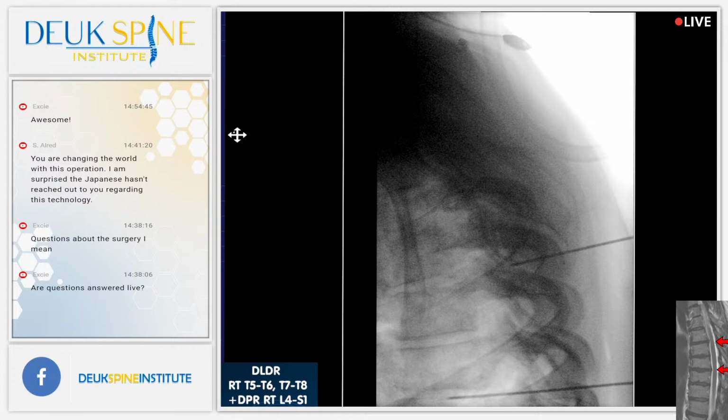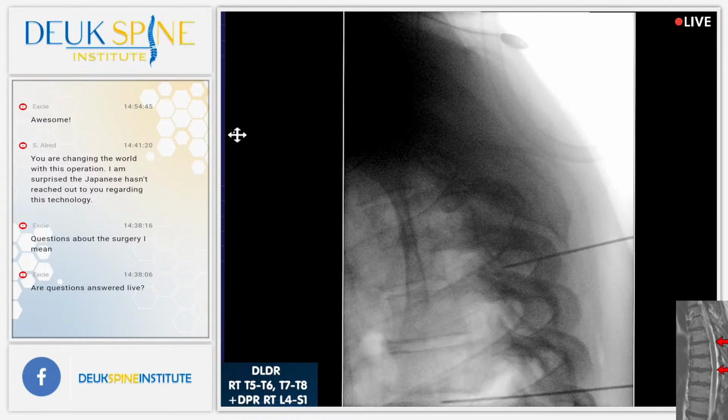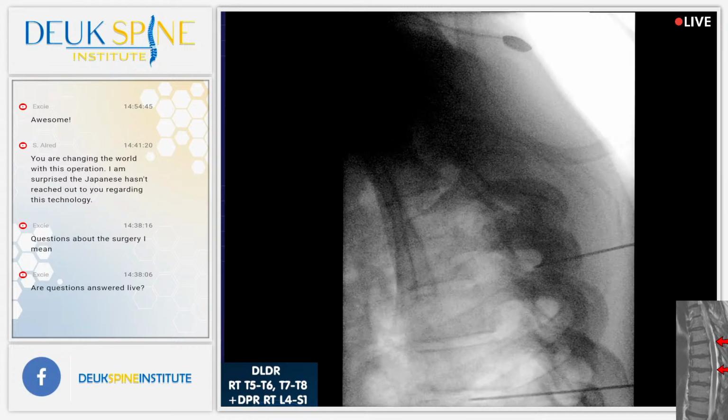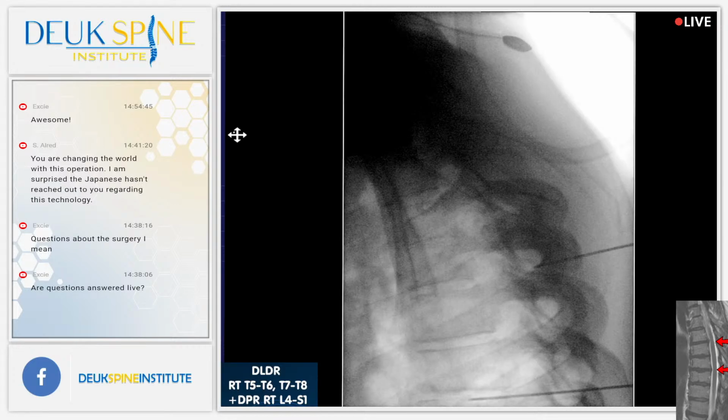Shot. What we're looking for is changes. Definitely worse at 7. So let's go back the other way. I think it is getting worse. The reason why the fluoro has to move around in an arc is some people have scoliosis. More? I think that's better, to be honest. I think you're getting in the right direction here.